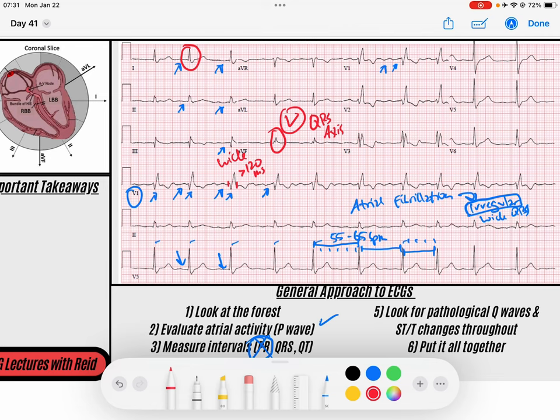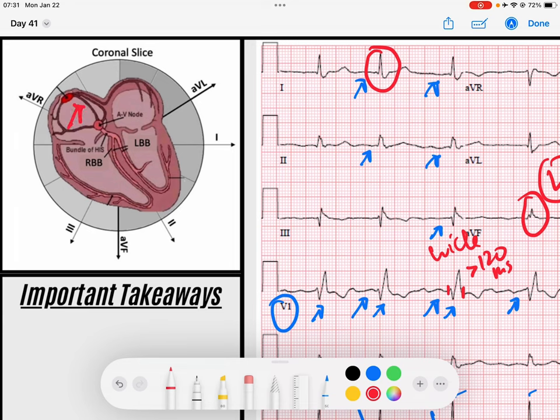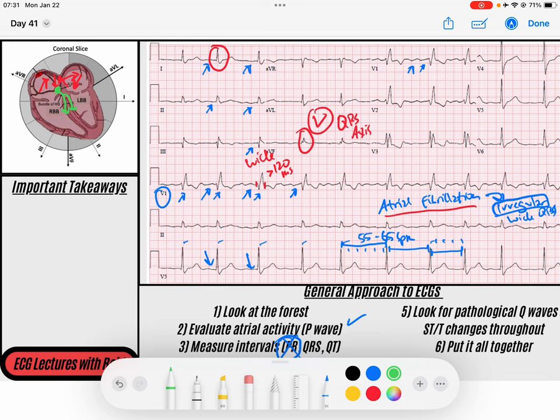A wide complex QRS could be coming from a ventricular ectopic beat, or it could be a bundle branch block. More likely in the setting of atrial fibrillation — where the atria are fibrillating all over the place but the AV node is letting signal travel down into the ventricles — if conduction is delayed through the ventricles in the form of a wide QRS, then maybe there is a bundle branch block.